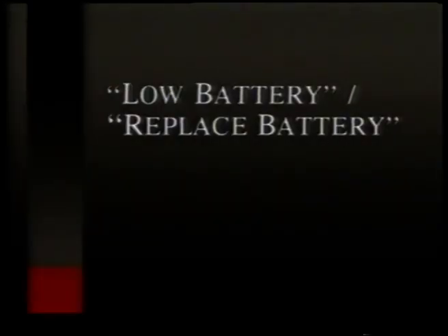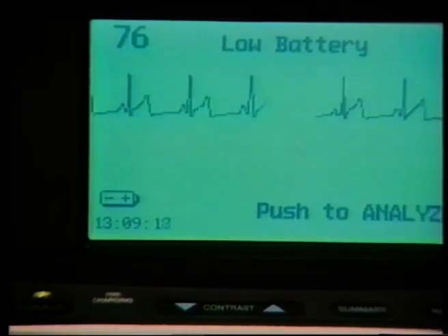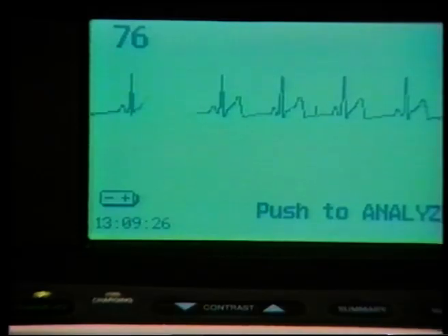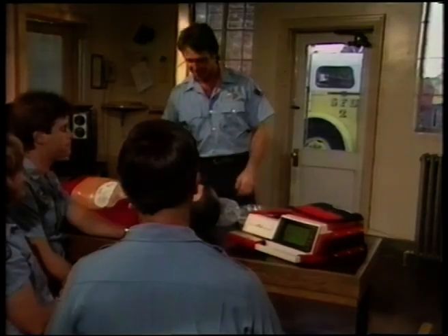Battery voltage is continuously monitored by the LIFEPAK 300. When the battery reaches low capacity, a low battery display message flashes continuously and a low battery voice prompt occurs. Simultaneously, a battery symbol appears on the lower left corner of the display. The LIFEPAK 300 battery pack has been designed to provide some operating time after a low battery display message appears.